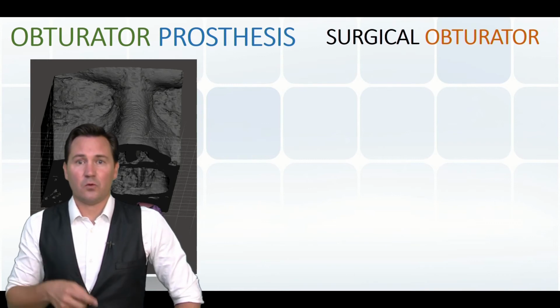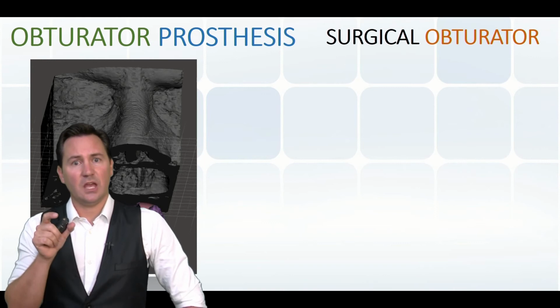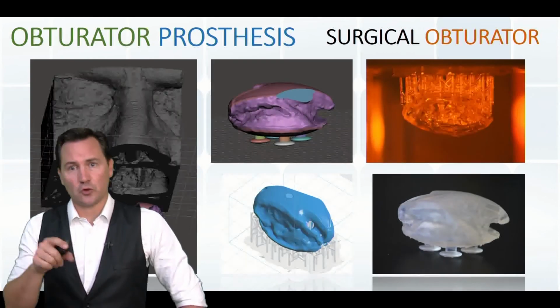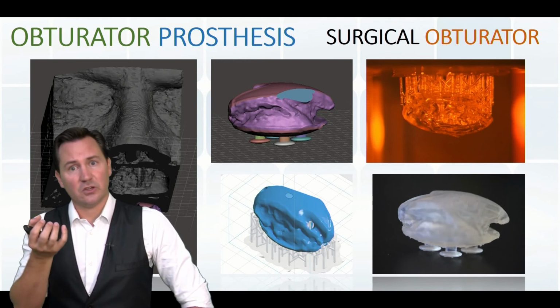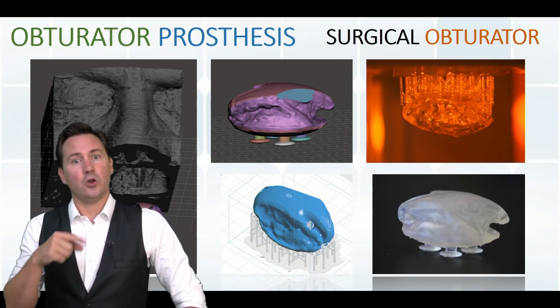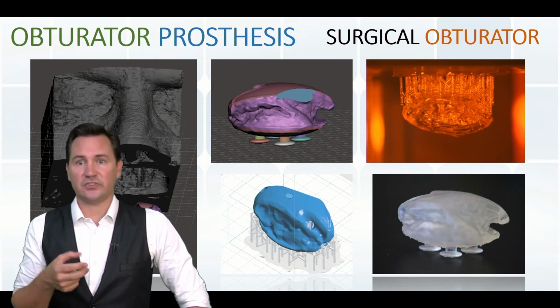So we actually are working on this concept by printing undersized obturators, which can be relined with a small layer of VPS after the surgery. As you can see, the surgeon performed the surgery digitally. With a Boolean operation, we design an obturator and remove the unnecessary undercuts. We hollow the obturators to be lightweighted, and we print it 10% undersized.